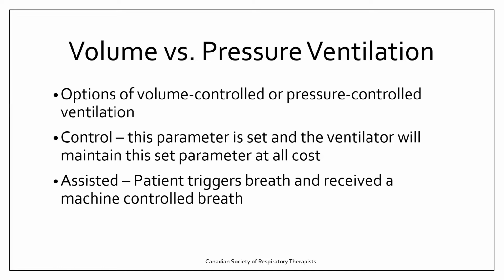So now we'll look at selecting the right mode of ventilation, and which mode of ventilation you may want to use for a patient. And really this can be challenging, even for people who are experienced. There are a lot of things that we need to consider.